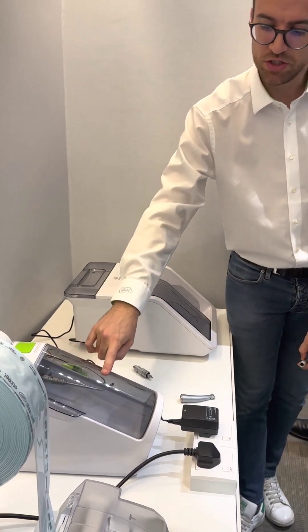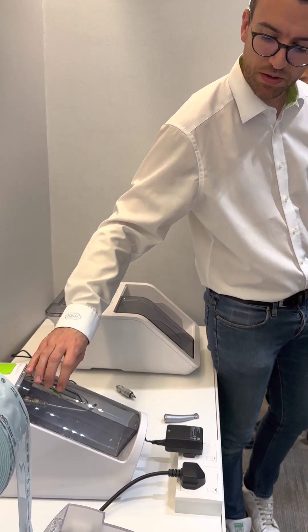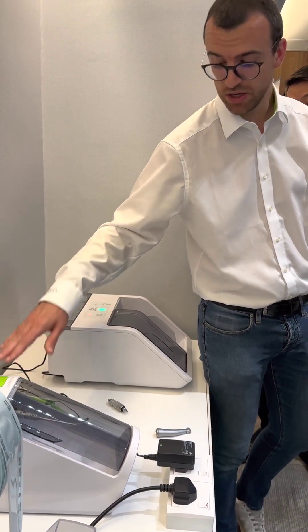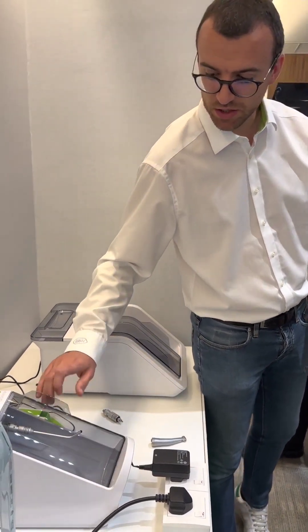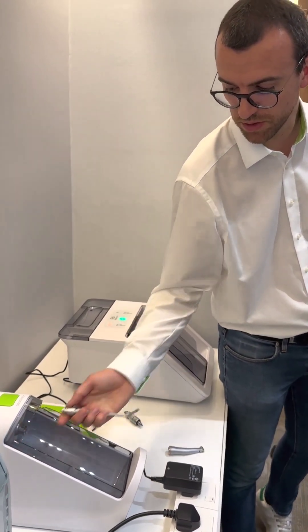Pay attention because this device does not have electricity and power supply, so pay attention to close the door properly. With the Assist in a Twin, if the door is open, the cycle does not start. But here, since there is no electricity, you have to pay attention to close the device properly.